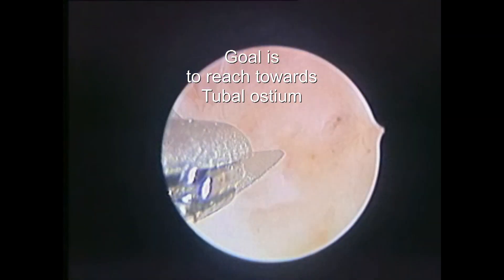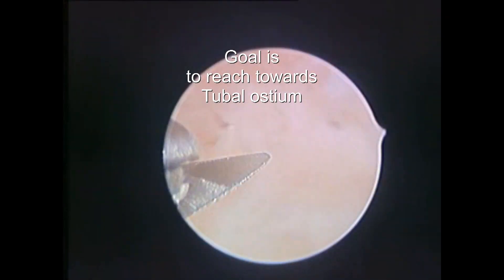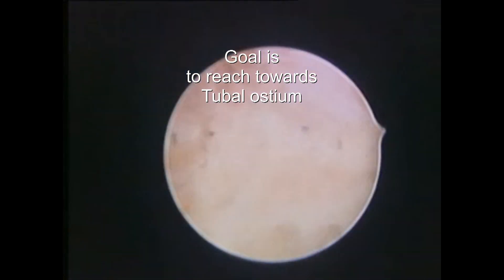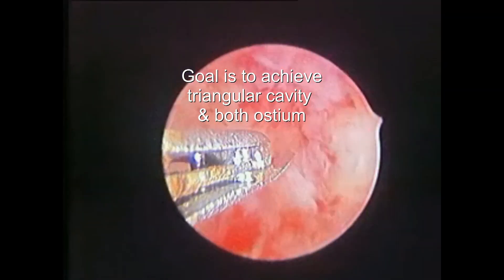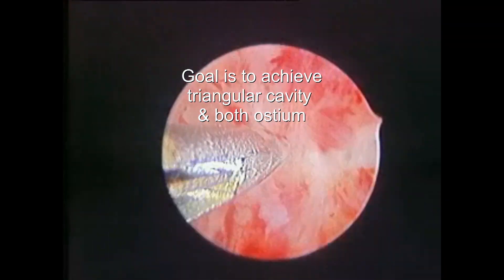While working at the cornua, you have to be very careful because the wall can be very thin and you may cause perforation. Near the cornua, perform only a few flimsy, superficial adhesiolysis cuts. On the right lateral wall, be very careful not to go too deep, as you may reach the vascular uterine lateral wall. Now this is the fundal part — you can see it clearly.